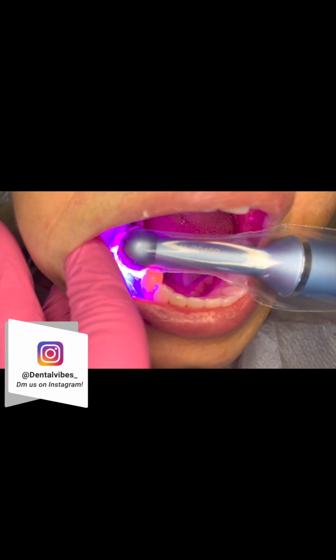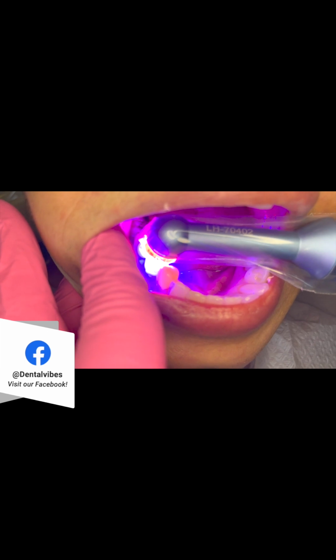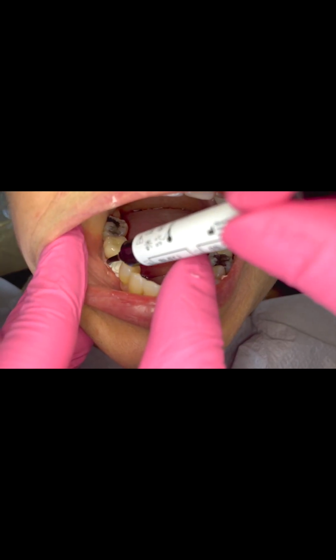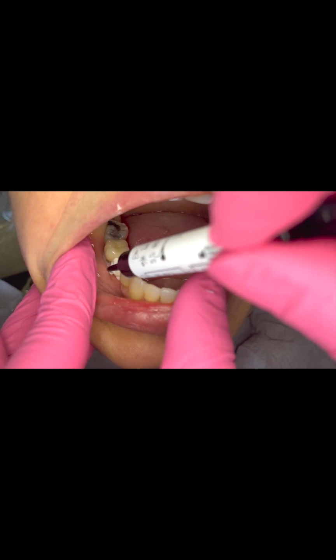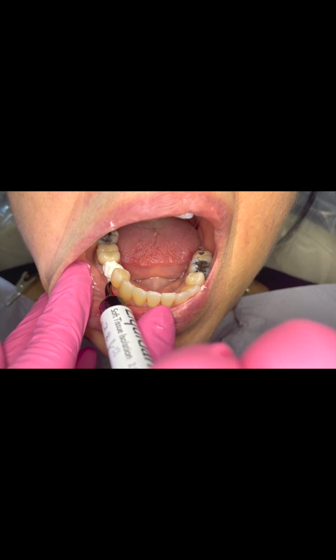And by the way, do not worry about that tooth getting stuck there. No, liquid dam is a great material for these things. You'll be able to flick it off. So just take your time and take a few minutes to build that tooth as best as possible.